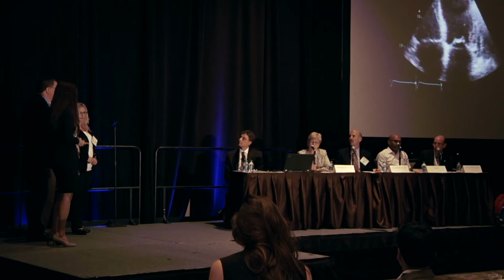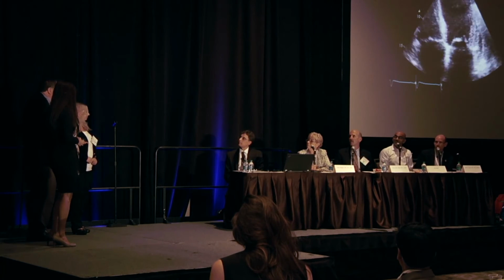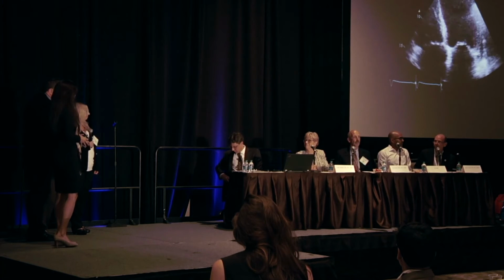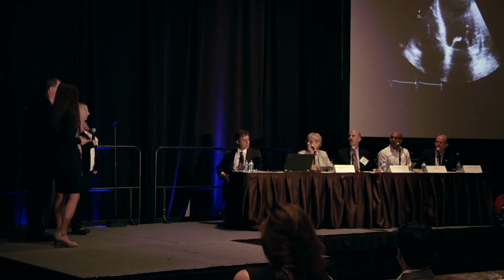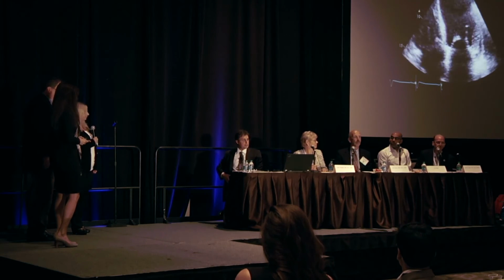We are not trying to say that it's better or worse than MRI. While that's true, you still have to compare it to something, you have to have a gold standard. That's why the gold standard is the average of multiple manual tracings done in manual echo.